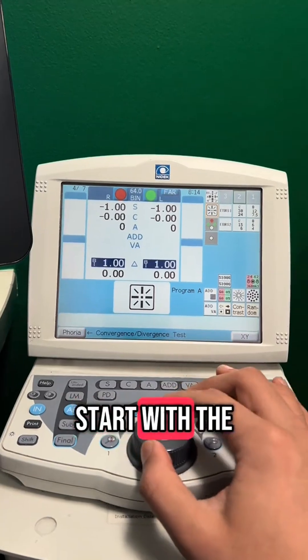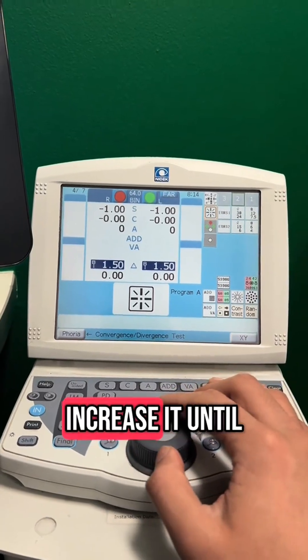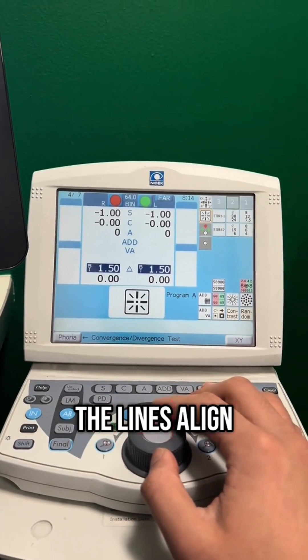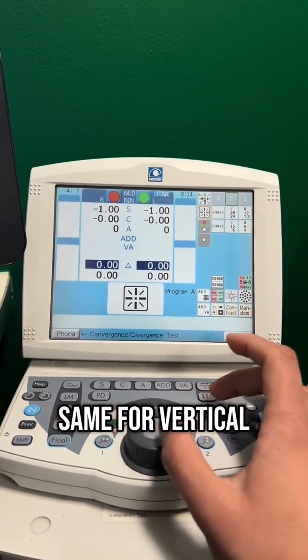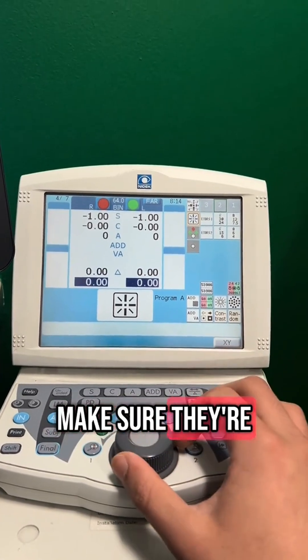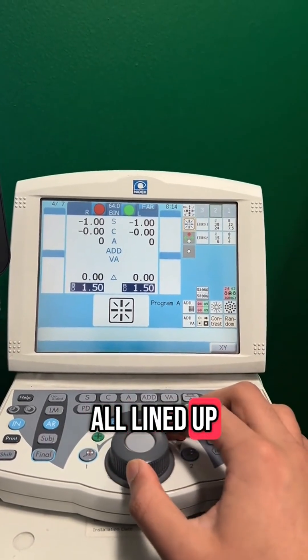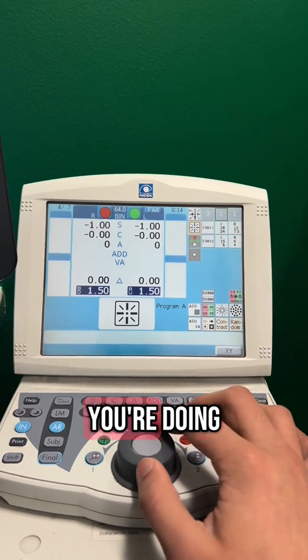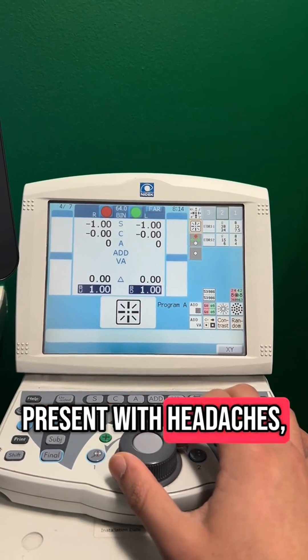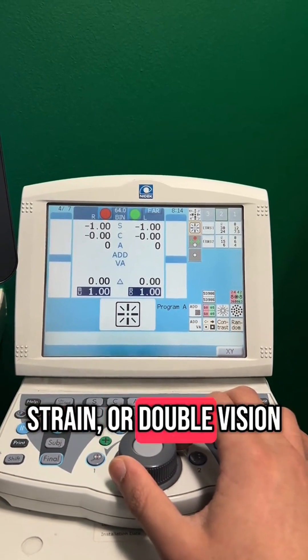Start with the low prism and increase it until the lines align. Then do the same for vertical and make sure they're all lined up. This is an easy test once you know what you're doing, especially when patients present with headache, strain or double vision. That's what you need to do.